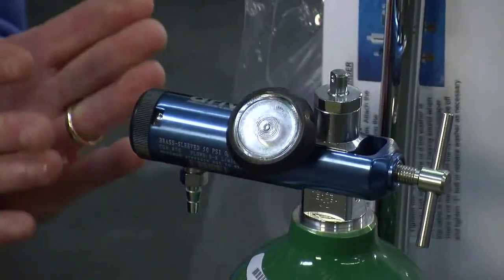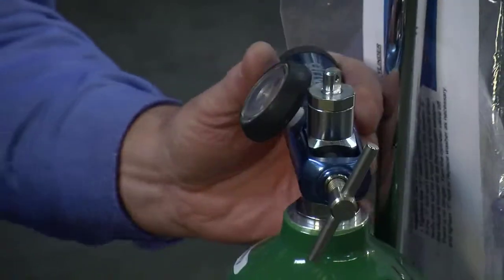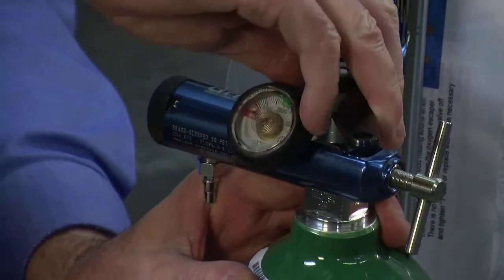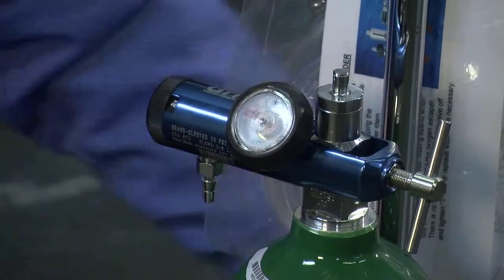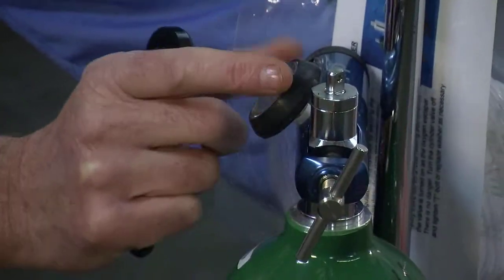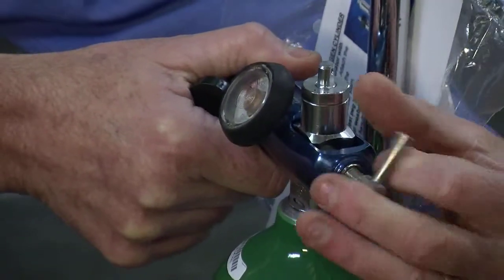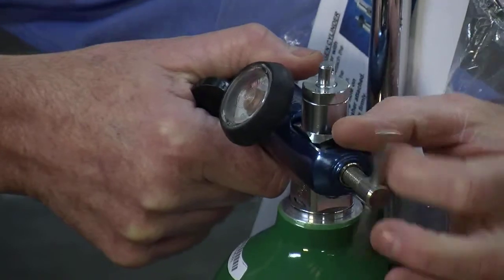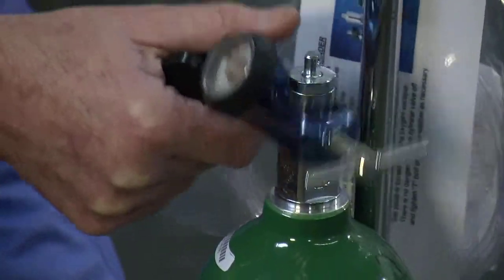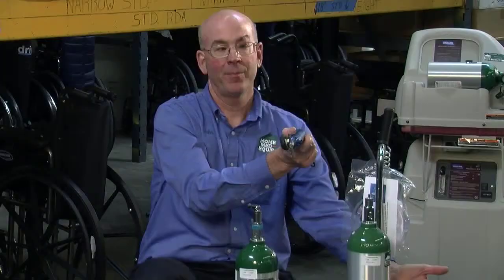To demonstrate changing the regulator from one cylinder to another, the sequence is to first make sure the cylinder is turned off by turning clockwise to close. Then come to the end of the regulator opposite the flow selector to the T — you're simply unscrewing it and the regulator will practically fall down, at which point you pick the regulator up.